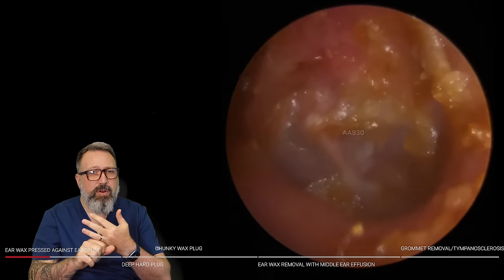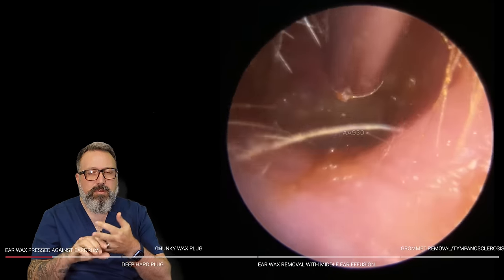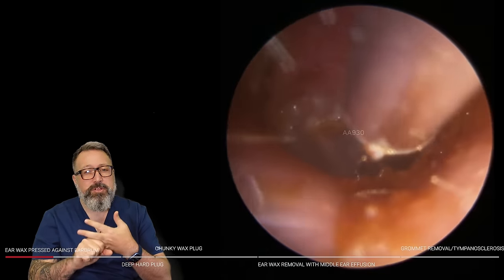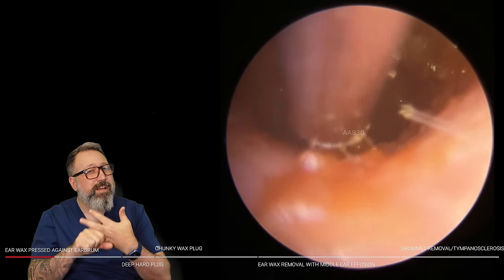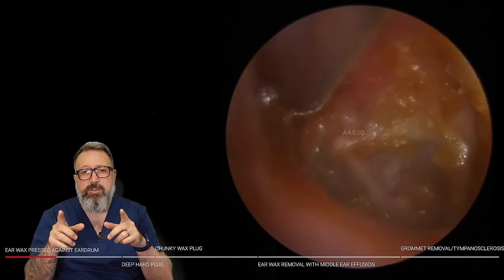We've got some quite interesting ones in this compilation today. There's a little bit of middle ear effusion a bit later on, and we've also got a grommet extraction, which ties in really nicely with middle ear effusion. So make sure you stay tuned for the last couple of patients in this compilation.